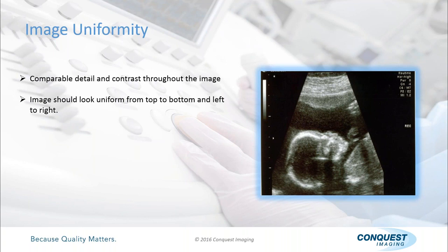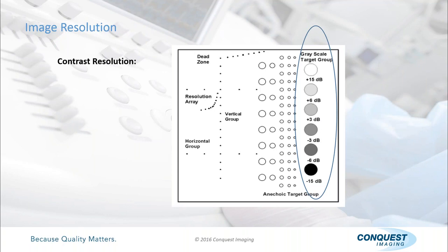No dropouts, no gray or black areas, horizontal or vertical, that are not caused by, for example, shadowing from bones, because they'll lose a lot of your acoustic power, and therefore they can cause shadowing below anything that you have that's a highly dense object. So this is a really good picture to look at. You'll be seeing it throughout the presentation because it gives a lot of information.